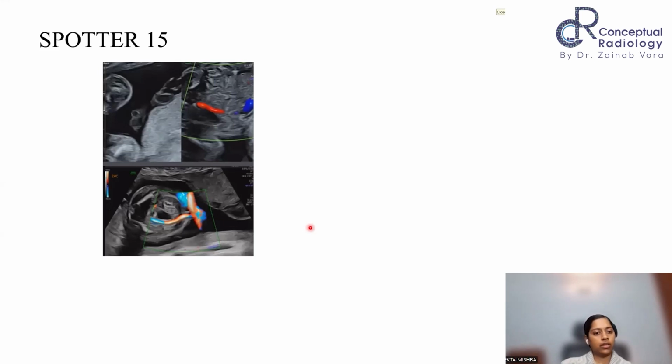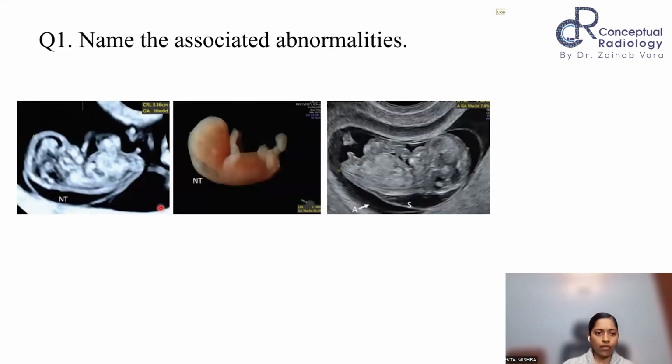Good. So this is the urinary bladder. I'm not able to see the other umbilical artery. So this is a single umbilical artery. What structure should I now look for? So single umbilical artery is associated with which organ's pathology? Most commonly seen in diabetic mothers. Now start looking for KUB structures, kidneys. Okay, so very good. Now we see a finding here.